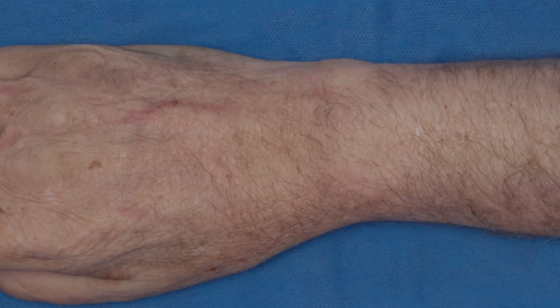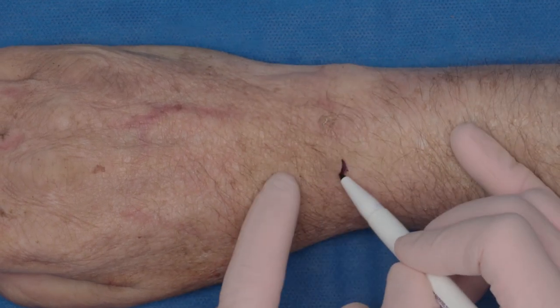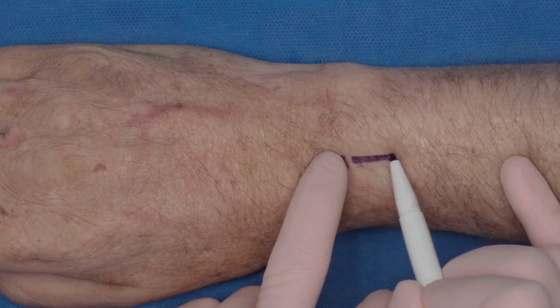For the purpose of this demonstration, we will go dorsal. First, I start out by finding Lister's tubercle. We can easily palpate here, and you go just proximal to this and make an incision.